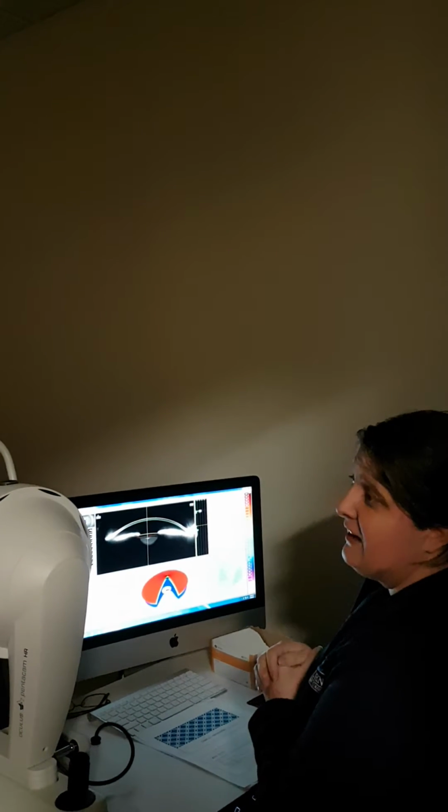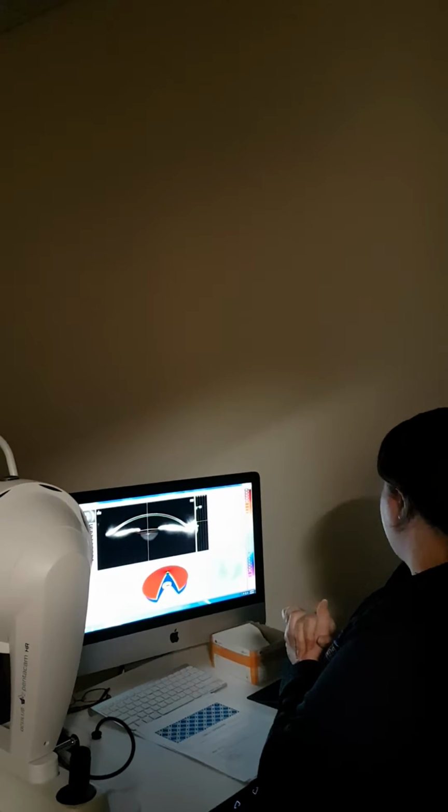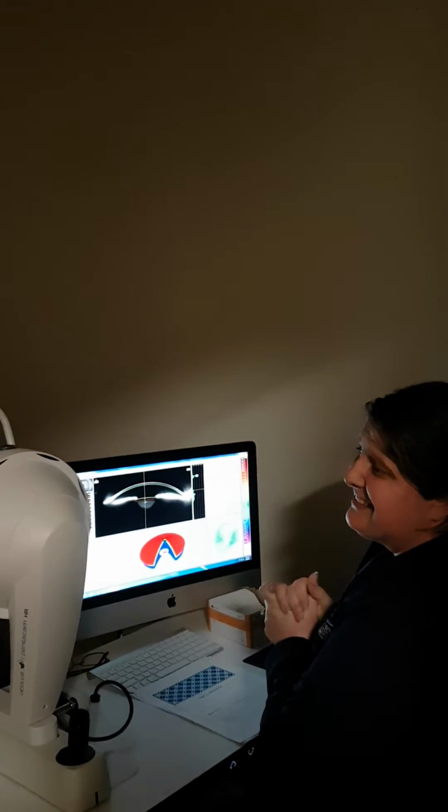Okay. You guys want to try and practice? Any questions? Sure.